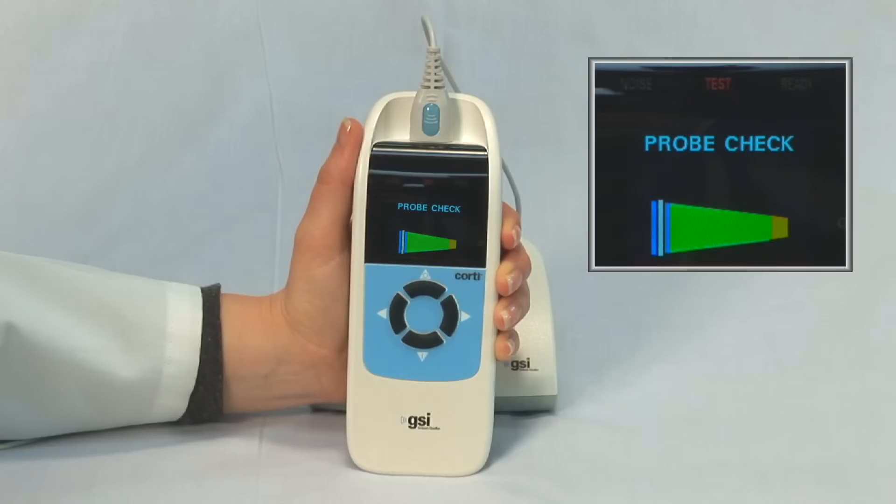If the probe is not seated properly and there is a leak, the probe indicator or white vertical line will be in the blue portion of the cone. If the probe is blocked or positioned up against the ear canal wall, the probe indicator will be in the yellow portion of the cone.